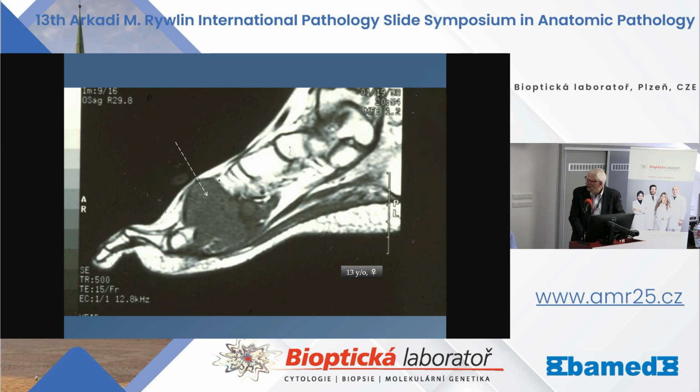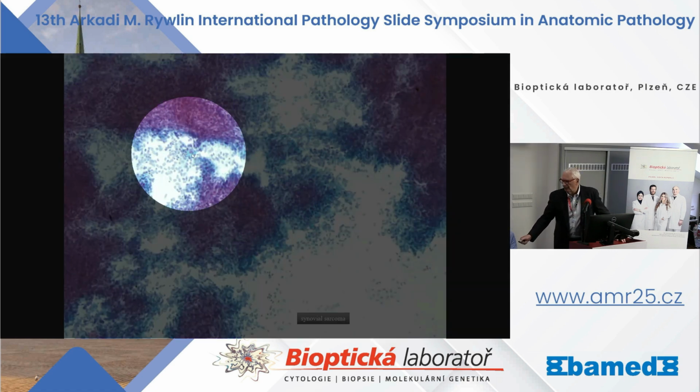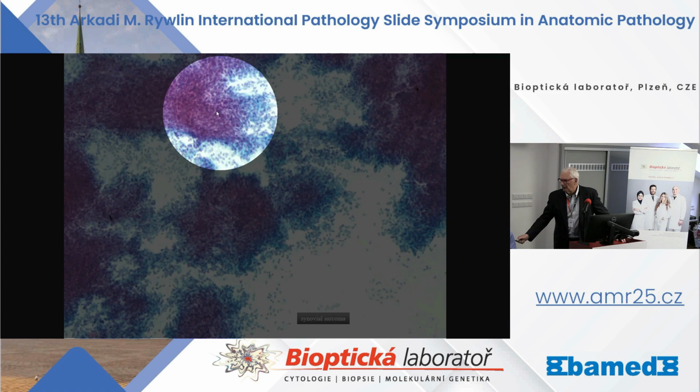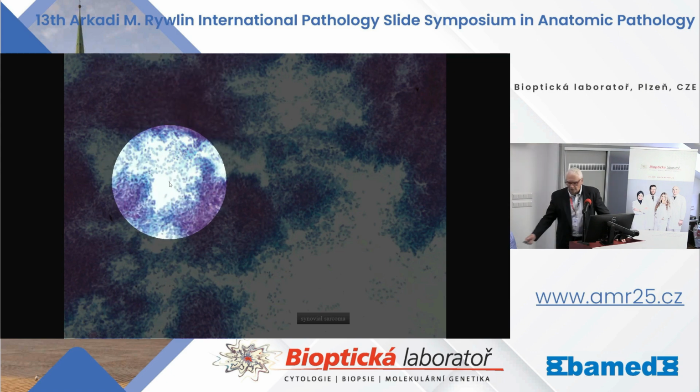So this is a case from many years ago. It's a 13-year-old girl. She presented with a mass lesion on the dorsum of her foot. The white arrow shows you about where I put the needle in. And when I put the needle in there, this is what I got. This is a Papanicolaou stain. It looks like almost the first slide I showed you for schwannoma. Extremely cellular. So cellular that in areas like this, 3-dimensional, thick clusters, one cannot look in here and identify or evaluate the individual morphology. You have to go down here and look at the material like that.